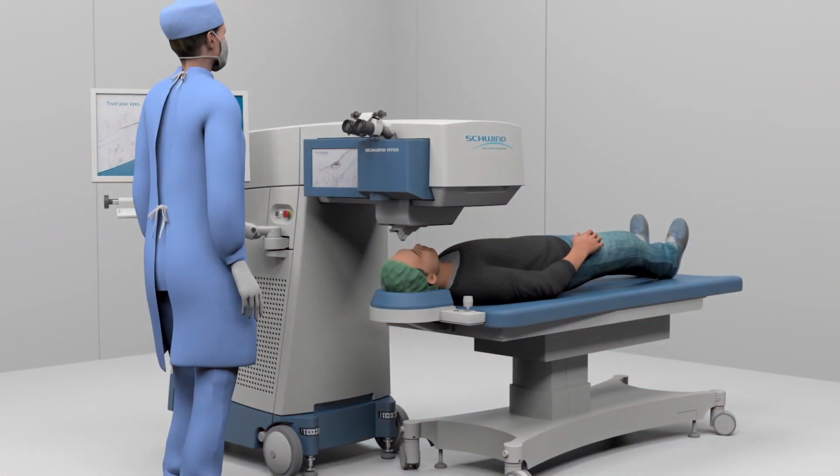First of all, we're washing meibomian secretions off the surface of the cornea. Then I dry the conjunctiva, including the fornices, which are the regions within the lids. And then I look at the head position and the nose position, and I'll tilt the head, lift the chin, and make sure they're in a comfortable position. I've already counseled the patient beforehand about the fixation light and what they will see and what they'll need to do, so they already know about that.